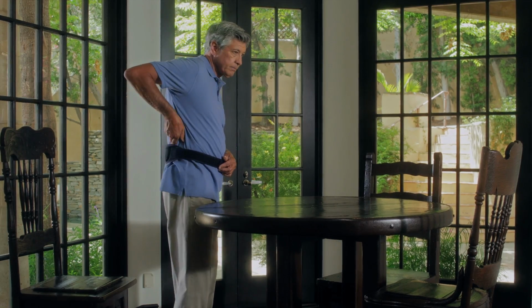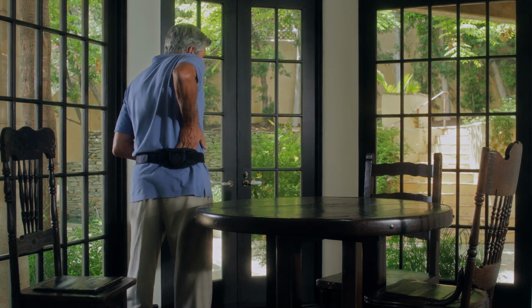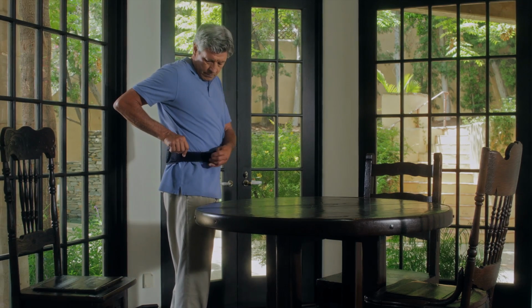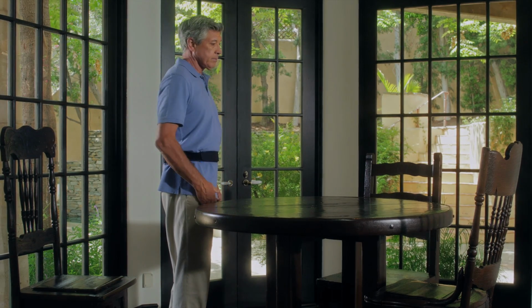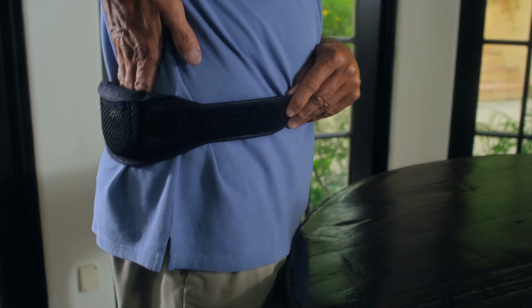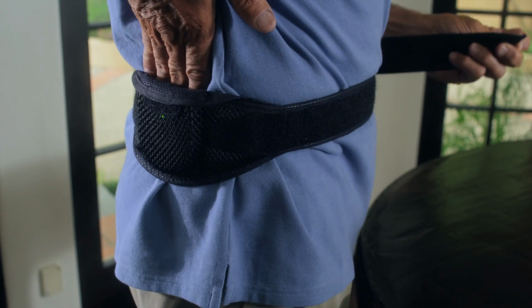For best results, occasionally check the charger to make sure that it's centered over your stimulator. If the charger is not centered over your stimulator, charging time will vary. Many patients are able to feel the implanted stimulator and can place the charger directly on top of it.